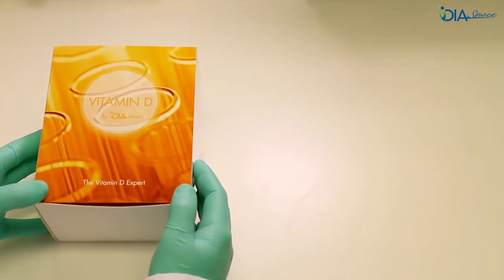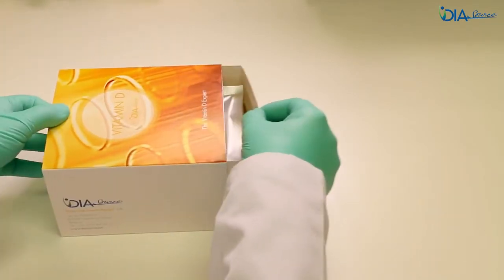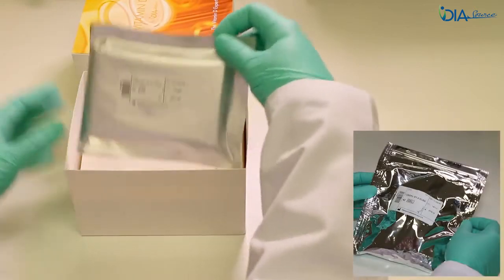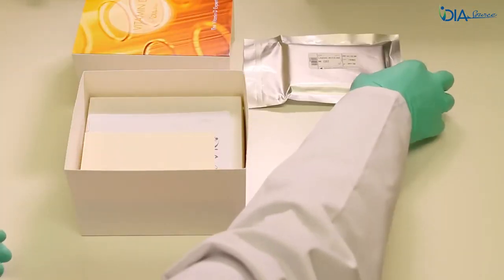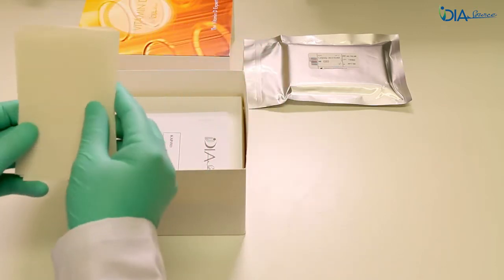The Diasource 1,25-dihydroxyvitamin-D ELISA assay is composed of two parts: the kit box and the silica cartridges. The kit box is stored between 2 and 8°C, and the silica cartridges are stored at room temperature.